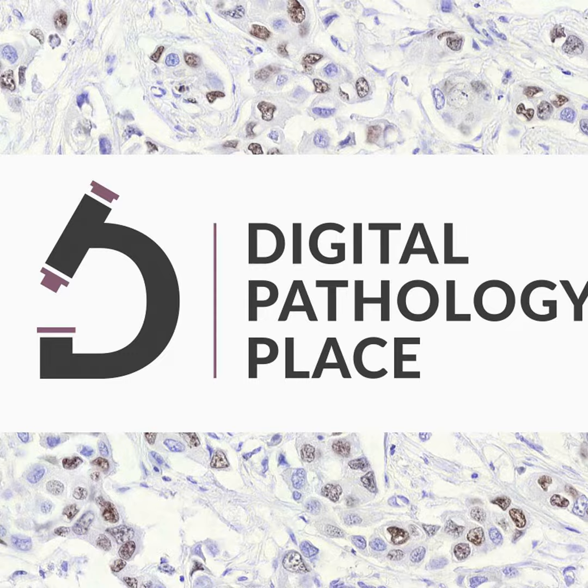So what I will say, and we'll talk about this a little later on, is that the algorithms that have been cleared by the FDA for use, there's a very small number of them. I remember hearing this, but I tried to look it up in a document and couldn't find it. The position has been that in order to get an algorithm cleared through the FDA or approved, if it turns out to be, it has to be done on a previously cleared or approved system.